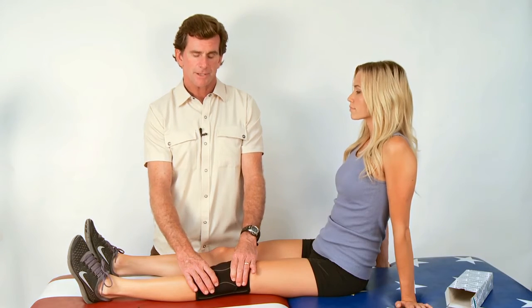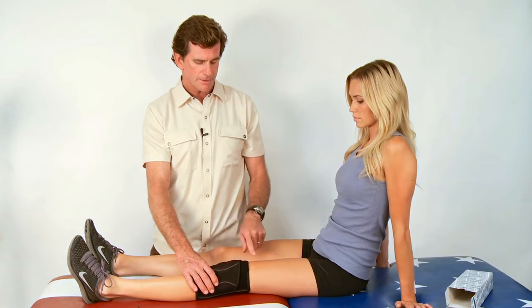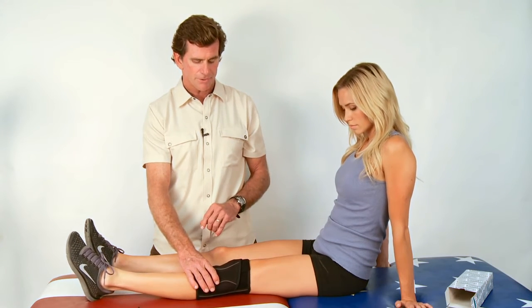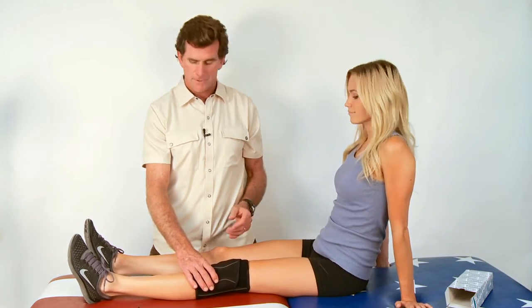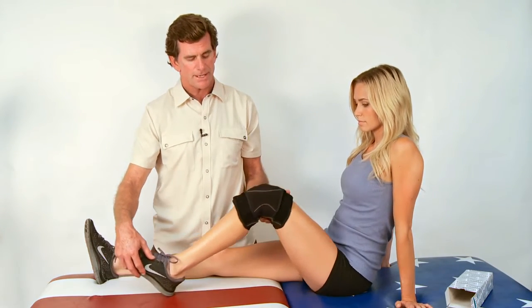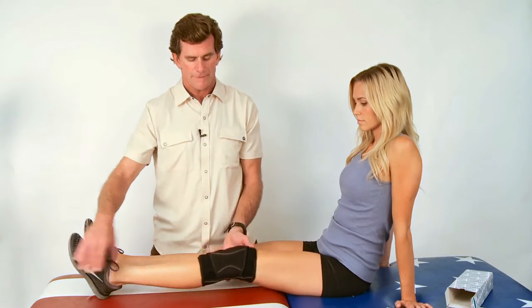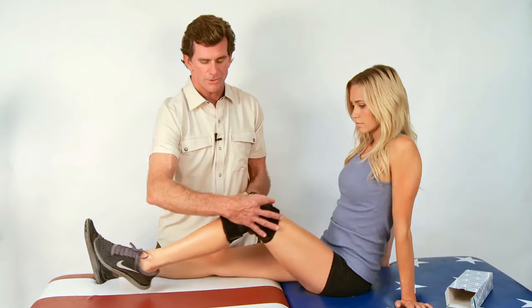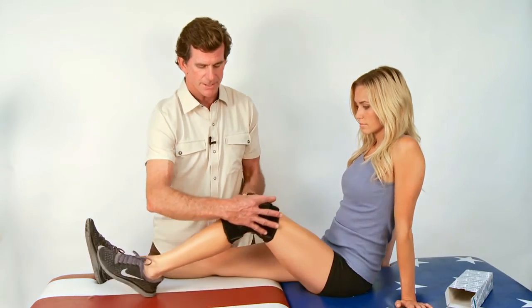After the application has been complete, I'll have the client continue to practice doing quad sets to see if in fact it feels more comfortable. Does that feel more comfortable? Mm-hmm. Usually I'll do a heel slide to show the client how that patella will effectively hold the kneecap in the position we want it to do, whether she's doing stairs and or exercises.